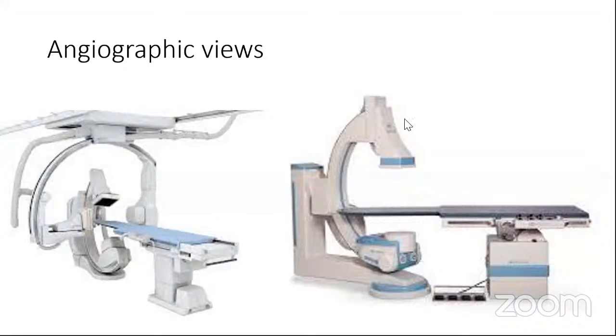We have two types of setup. We have the monoplane, a single C arm to take the pictures, and the biplane with dual C arms. Now, a biplane system can prove very beneficial, especially in renal impaired patients, because it will decrease the amount of contrast used by half, because we are taking two views simultaneously.